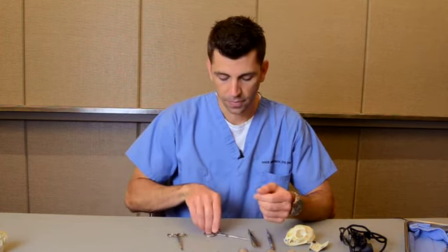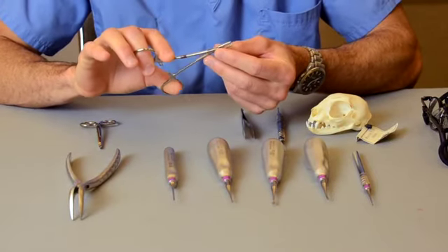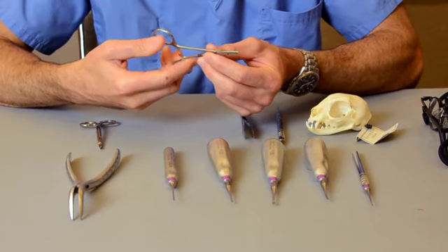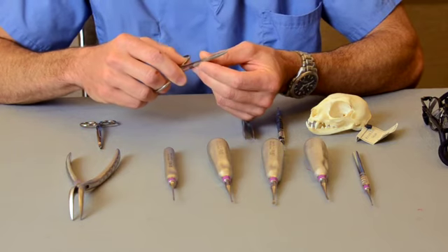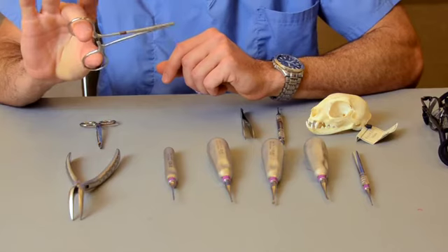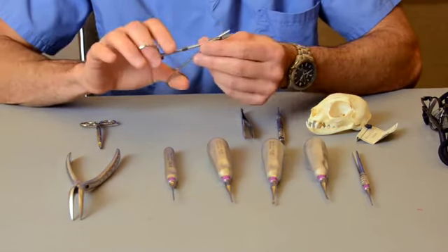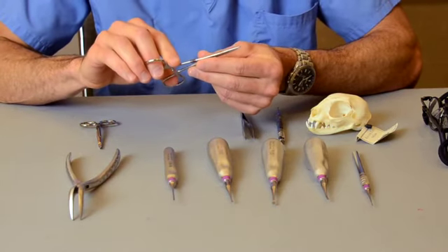And then finally, a very fine needle holder is important for working in the mouth of a cat. You don't want to use the type of needle holder you'd use for a spay or a general surgical procedure in a large or medium-sized dog. This is a very small, this is even less than 4 inch. I believe this is a 3.5. Anywhere from a 3.5 to 4.5 inch size needle holder would be acceptable for working in small dogs and cats in oral surgery.